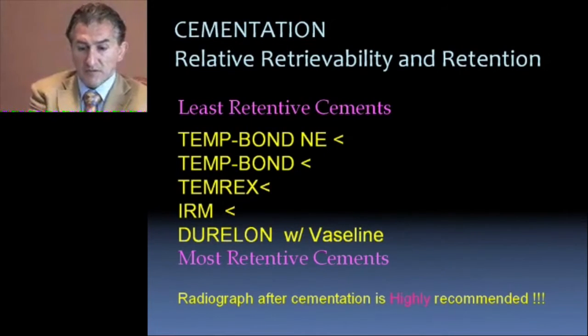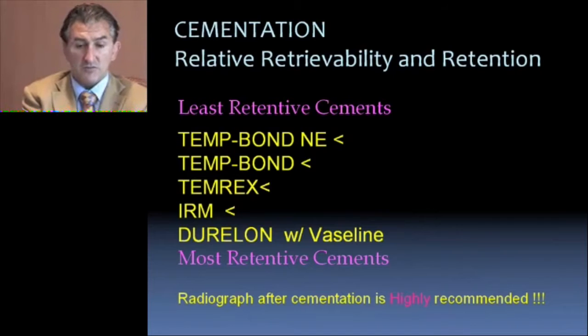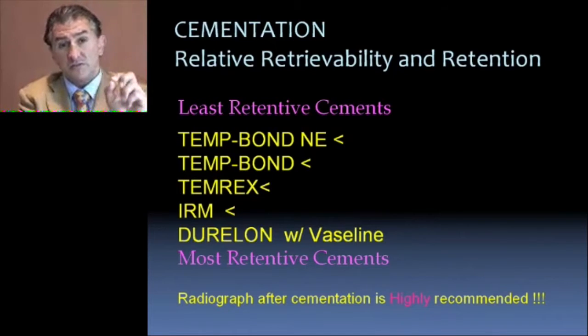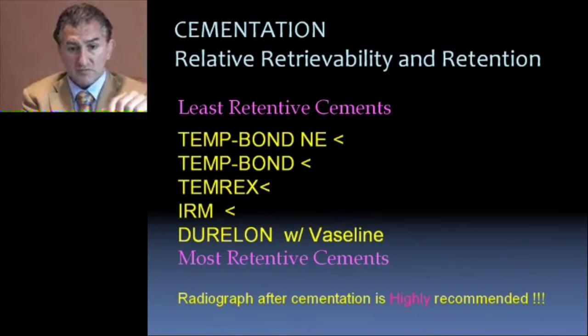If we have medium to short type of implant abutments, we'll go to a Temrex or a Durolon with Vaseline, and those become very retentive. So the radiograph after cementation also is highly recommended to make sure that there's no excess cement in the tissue areas.